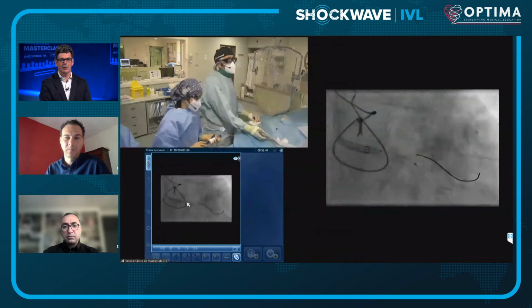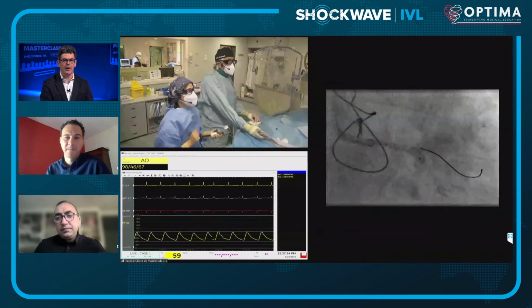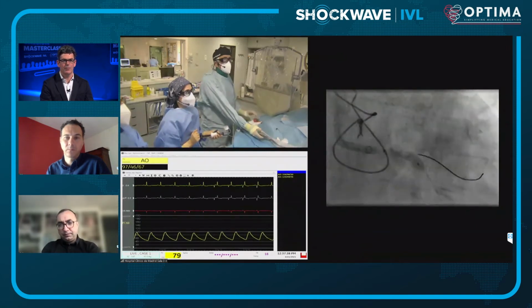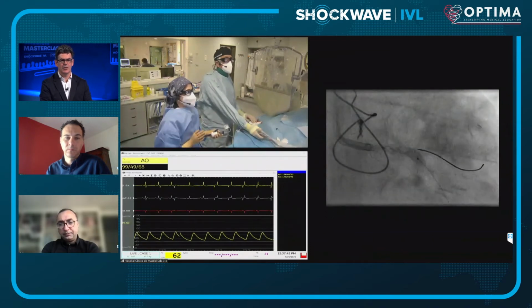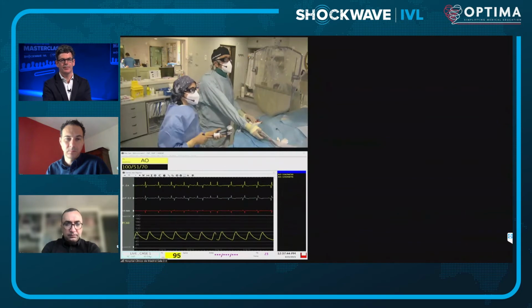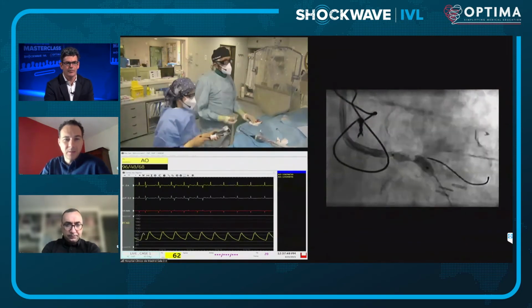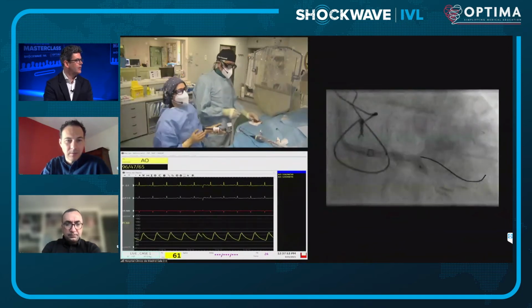So I think deliver all the rest of the shocks. The patient's been stable throughout. No hemodynamic consequences here. No. You see the EKG, you can see that there are some captures. But is it capture or is it just spikes without capture? Yes, I can't see.